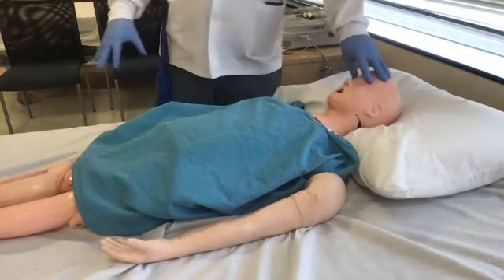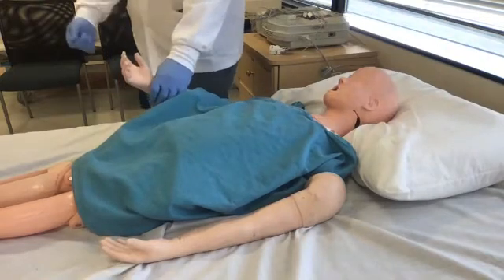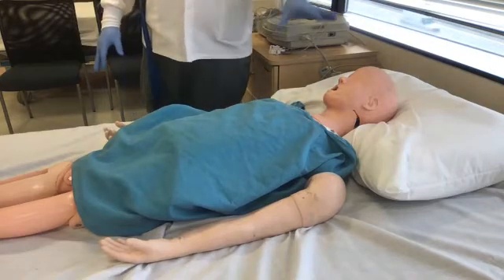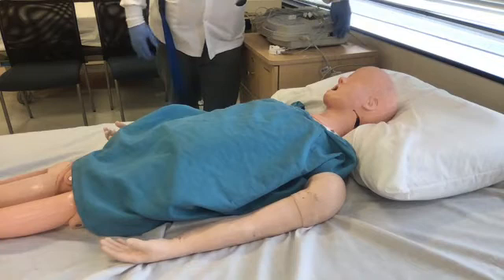So back to what I was talking about. How do we identify our patient in a typical office setting? He doesn't have a band. If he has a band, what do I do? I take the scan, beep, and it's going to pop up on the screen, your electronic medical records. And also, these things, even this one's old school, but it has a SCSI port, if you see here.